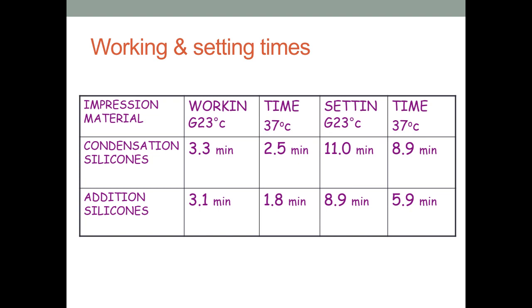Then the working and setting time. As you can see in the slide, these are the condensation silicone and addition silicone working times, dependent particularly on temperature and time. So if the temperature changes, the time can change.